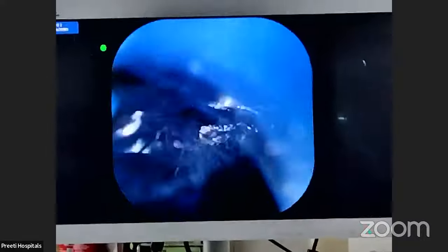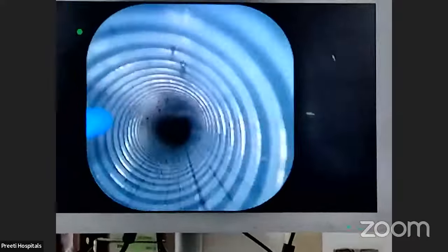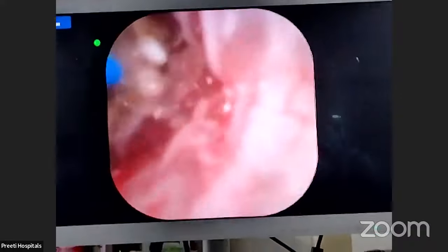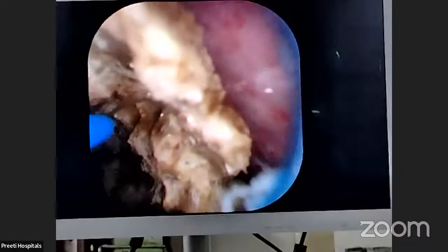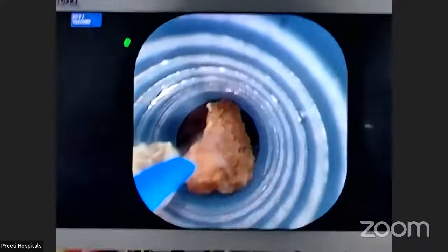What if you don't let them go out? They will accumulate by the side of the sheath. So the sheath may get damaged. The sheath may damage the outer sheath of the flexible scope. Okay, sir, not the inner sheath. The flexible scope may crush between the stone and the sheath. See, it is coming out.